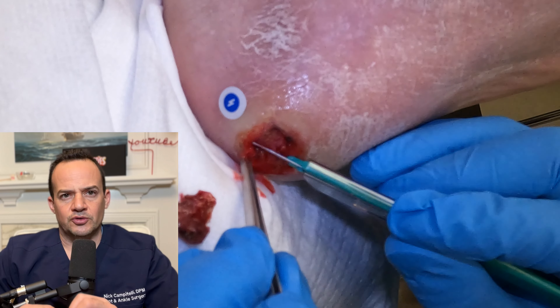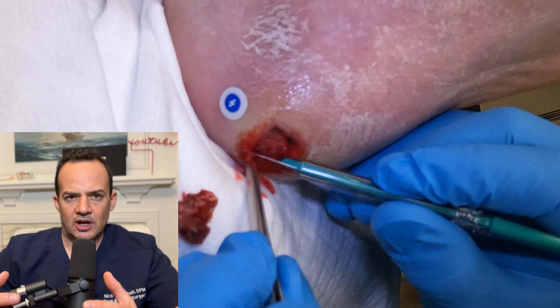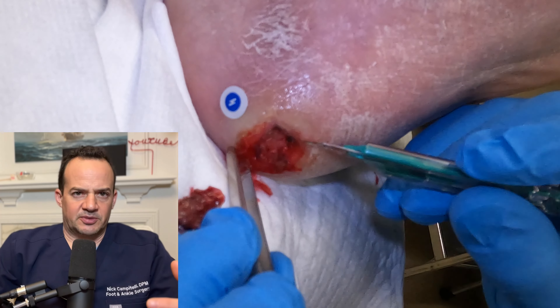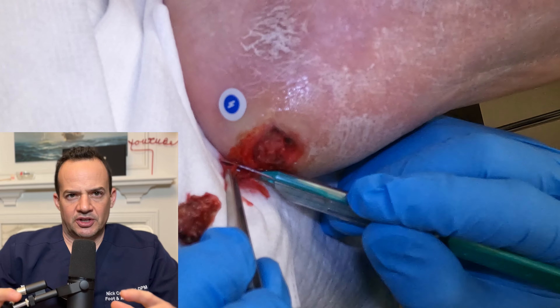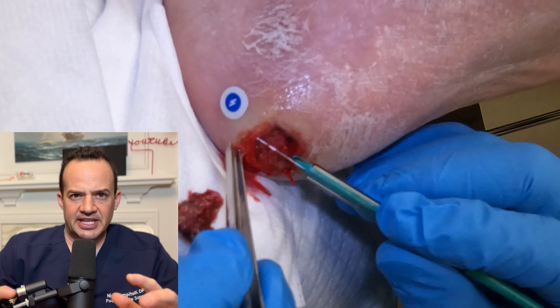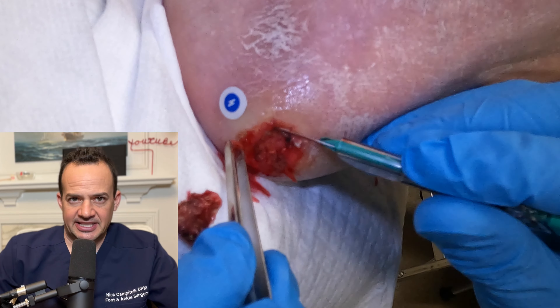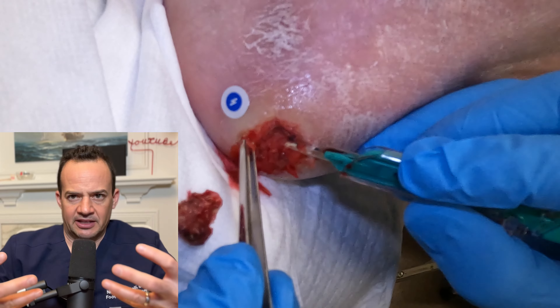What you're seeing here is we're removing areas of the edges of the skin. One way I and some colleagues explain this to patients is: you're turning a cliff into a beach. Those edges of skin that are like cliffs — we want to bevel them and make them like a beach, so that the sand runs into the wound and the wound will then granulate and fill in.